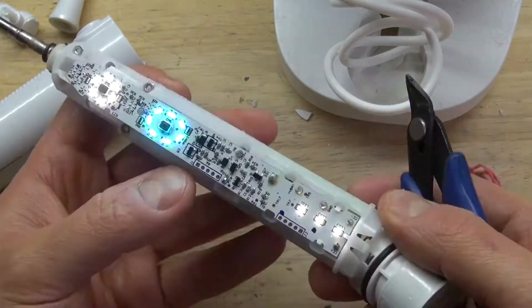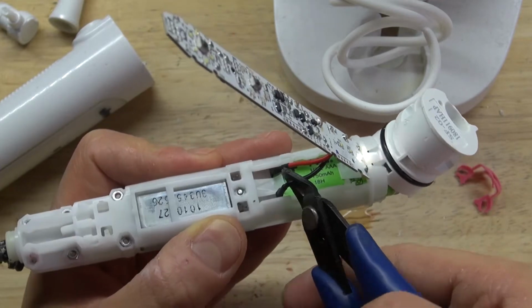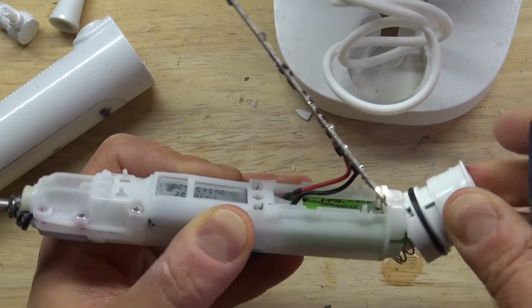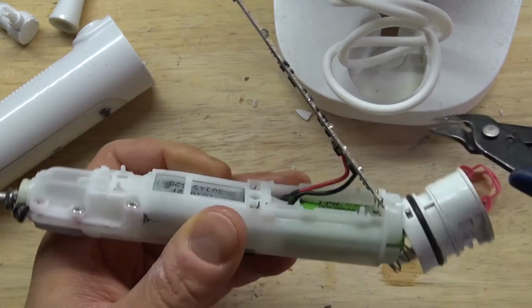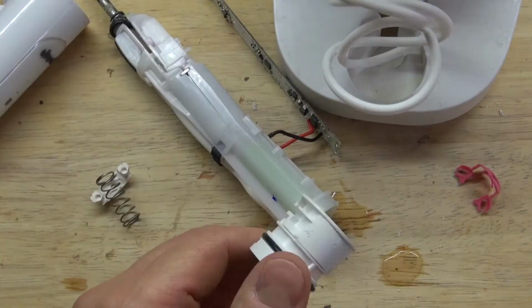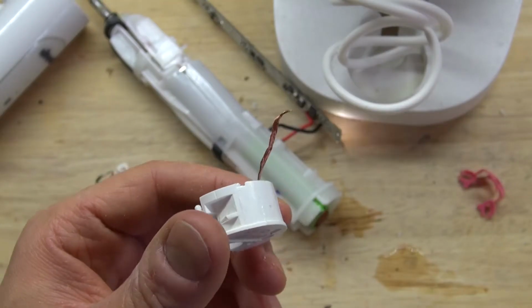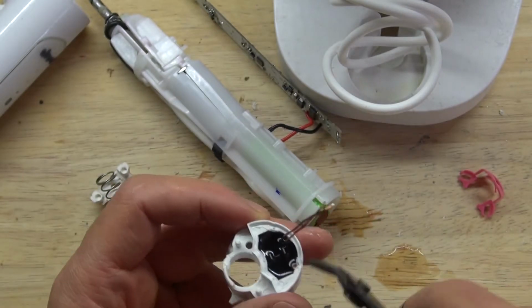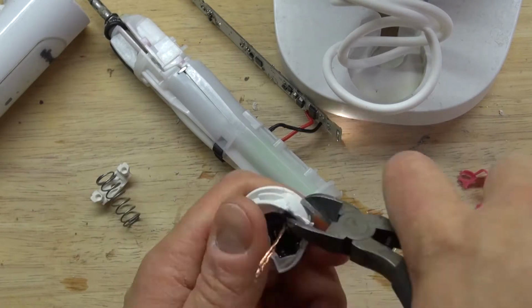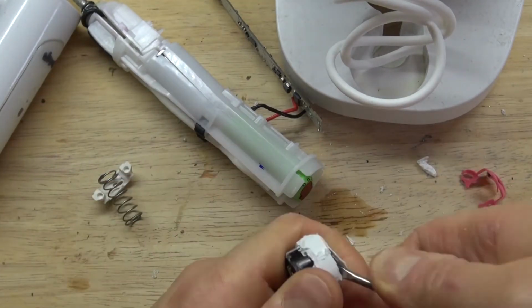I don't want to mess with desoldering, so what I'll just do is cut the wires. It's a lot quicker and easier. And there, the bottom part of the circuit is now removed. I'm very curious to see how this bottom piece works because this bottom piece is where the wireless charging is. I'm just simply going to take these wire cutters and cut it up, and basically chip away the plastic, allowing me to reveal how this device works.